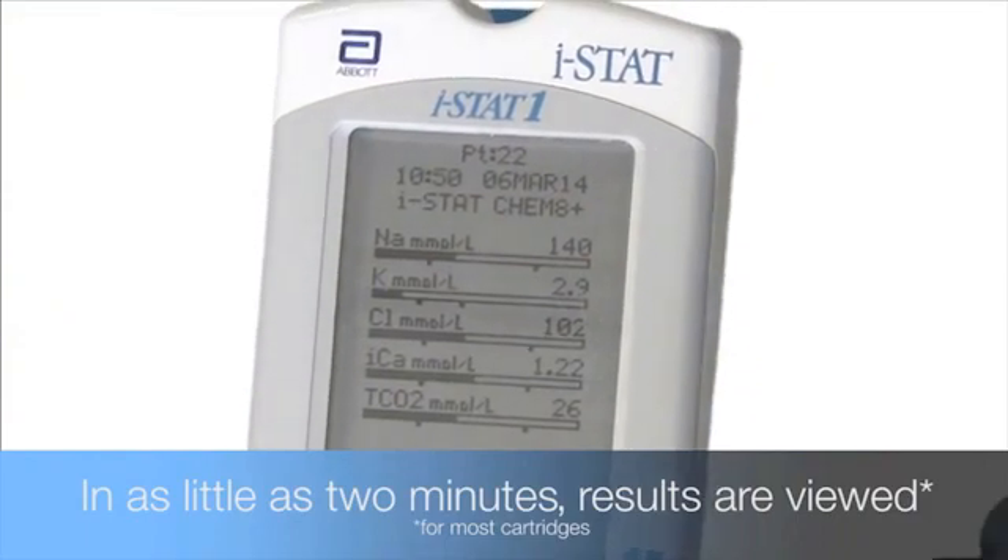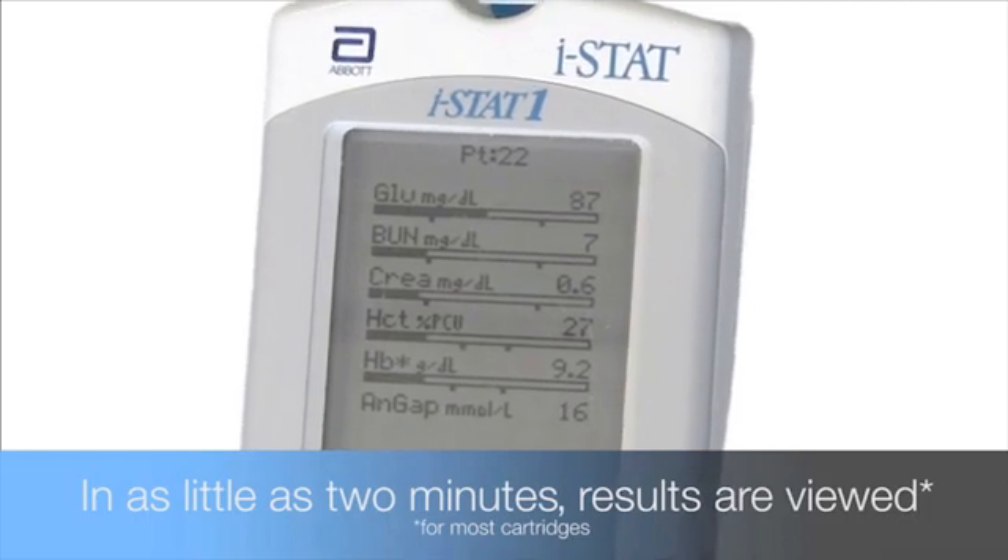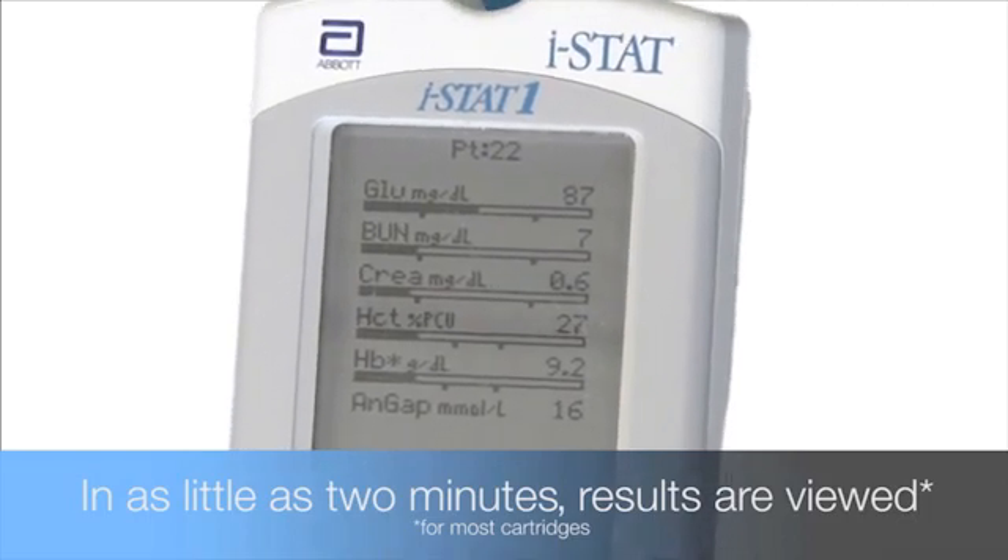In as little as two minutes, you can view results, making the iStat Analyzer one of the fastest methods for analyzing patient blood samples on the market.